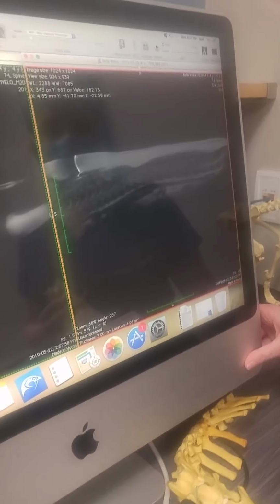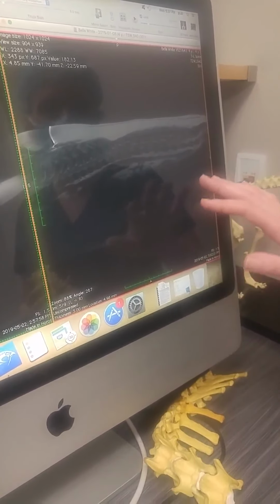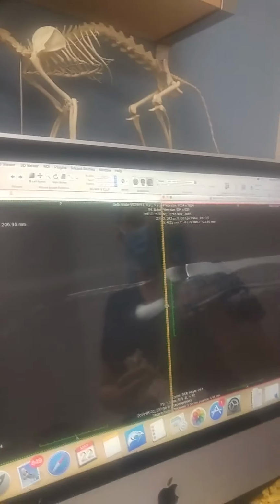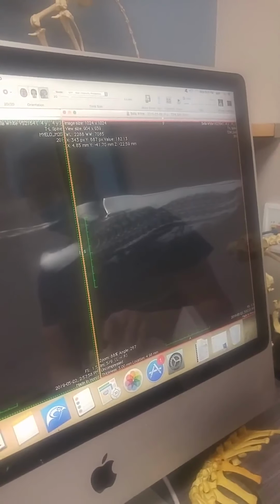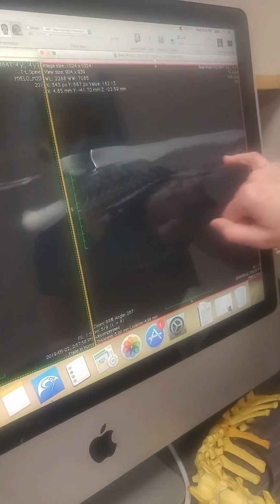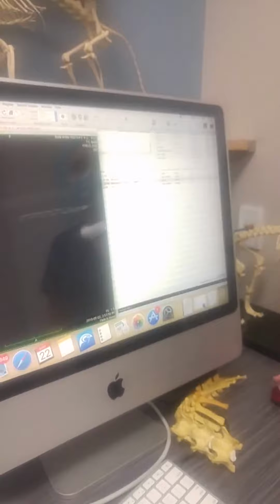But just so that you can see the shape of that first image, because I find it's the easiest image to understand. So that's the most detailed one: a slice in the middle looking from the side. And the spine is all of that, okay? So with my vertebrae, and then my spinal cord is the gray line in the middle. So it's relatively straight, right? So let's go back to Pistachio.